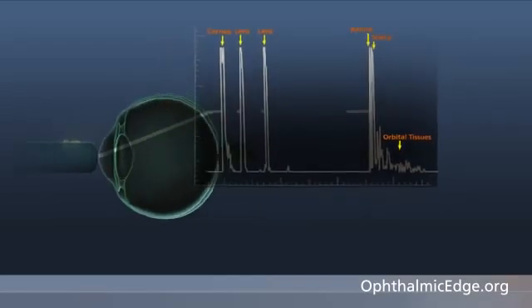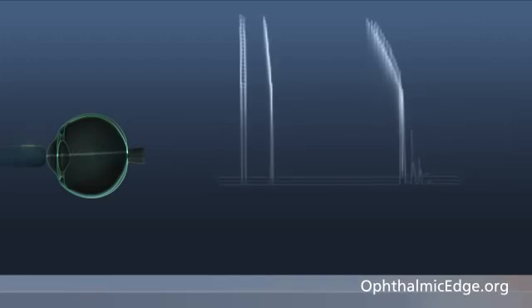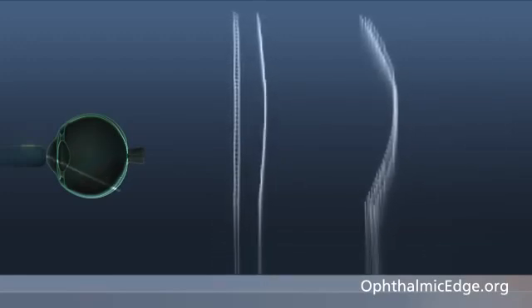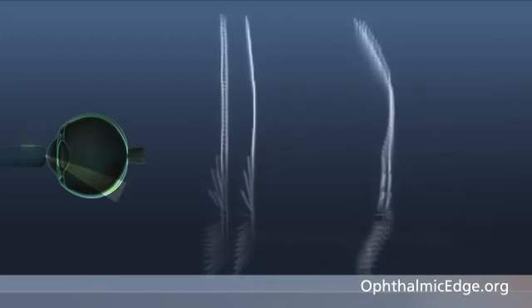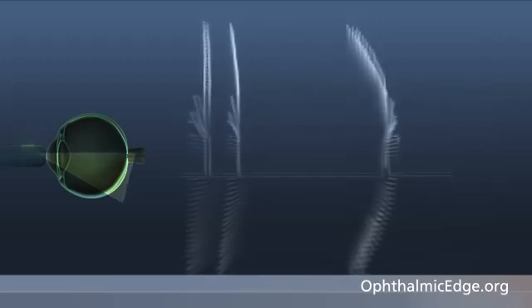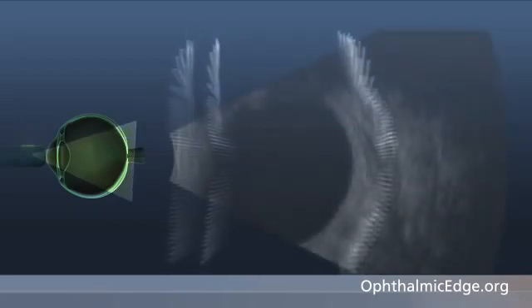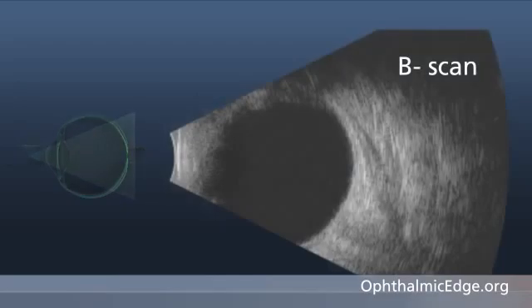But how can you make that into an intensity-modulated system, a B-scan? If you move the probe up and down the eye, maybe 125 different places, and took an A-scan from each one, and then carefully picked them up, turned them 90 degrees, those lines would come forward enough to cause the phosphors on the front of a screen to glow, and they would give you 3 dots. Connecting the dots would basically give you a B-scan.